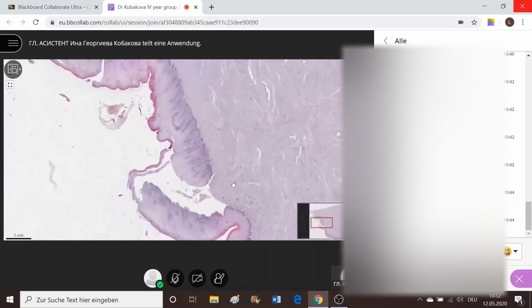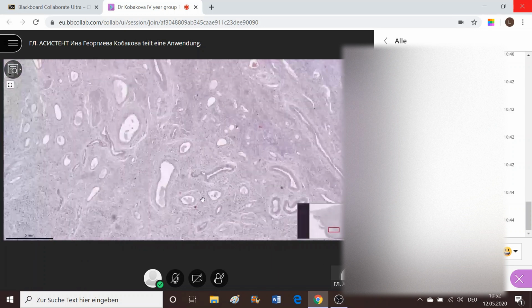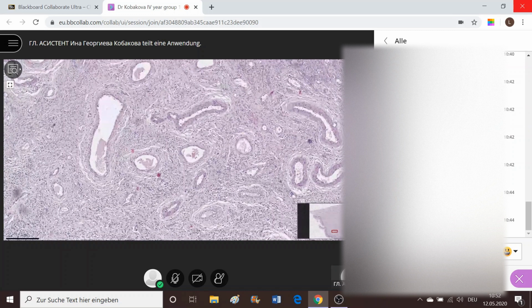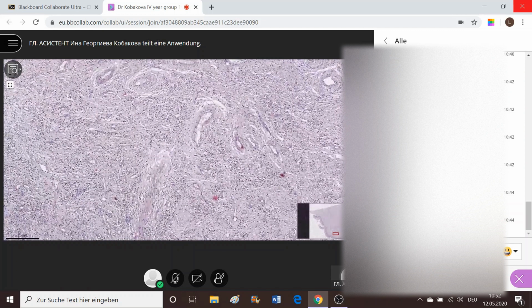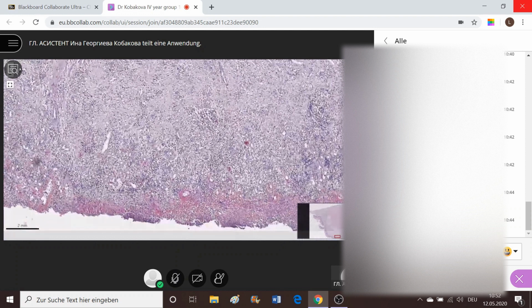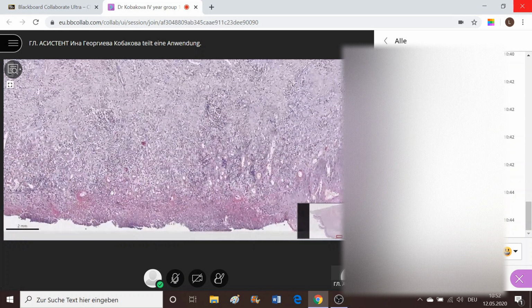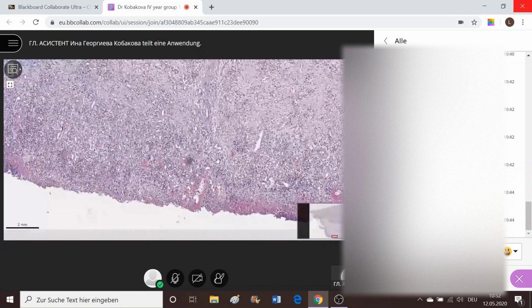And by the method of exclusion, we reach the idea that there are lots of glandular structures on the inside, which are normal to be found inside the cervix. Fibrovascular stroma, which is merely well observed. And there is a specific field in here, which is having sort of necrotic changes, erosive ones, where only the underlying soft tissues are observable, along with formation of fields of granulation tissue.